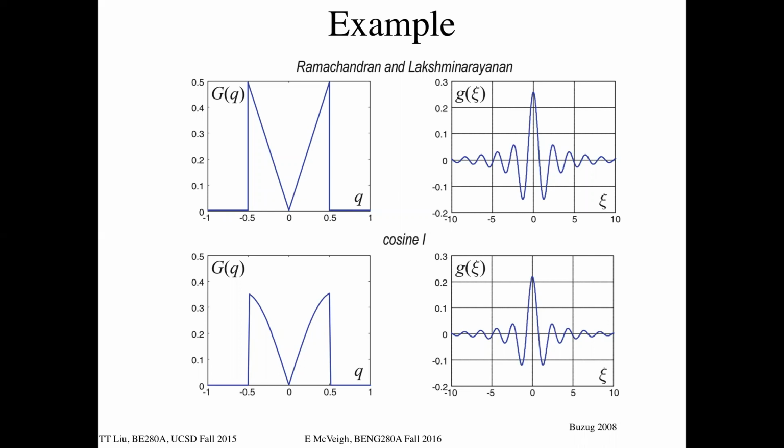Where we've got some data in G_L theta. We look at it in Fourier space, and then we multiply it by this thing, which is a filter, right? This is not a low pass filter, right? A traditional filter, you say, oh, I'm going to get rid of all my high frequency noise, has a big value at 0, and then it rolls off at higher frequencies. And that's a smoothing filter. This is anything but a smoothing filter. It is not a smoothing filter, right? It amplifies values at higher and higher frequencies, right? And so the high frequency values get amplified more than the lower frequency values.